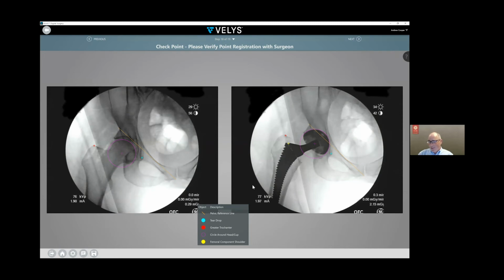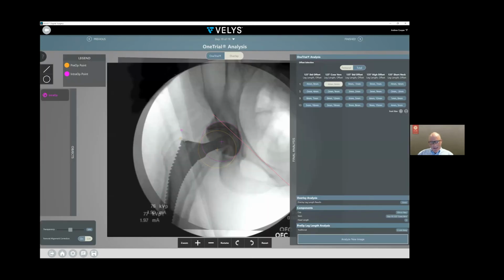And so my workflow is I literally take the x-ray on the right, I'm operating, I have more registration going on in the back end of the room, and then I get a data chart. And before I look at the data chart, as probably people know from overlays, we are counteracting for a lot of the inefficiencies of X-ray that we try to do with our eyes: rotating, translating, transposing images, correcting for abduction, adduction differences of the femur, all the things that we like to do to get the images to match and to get proper data.